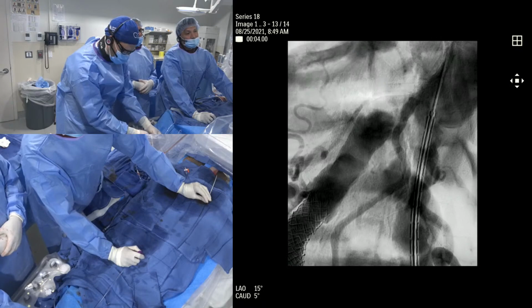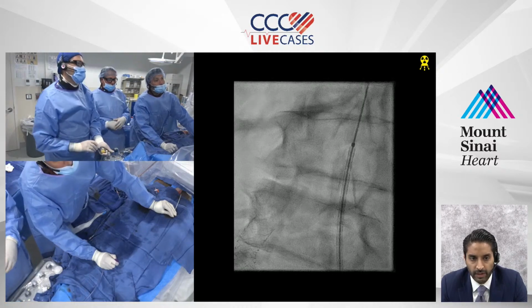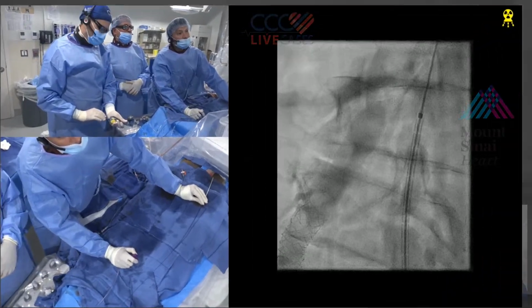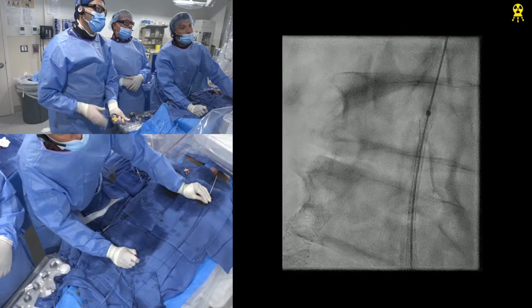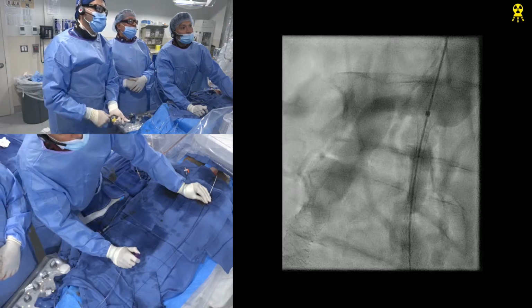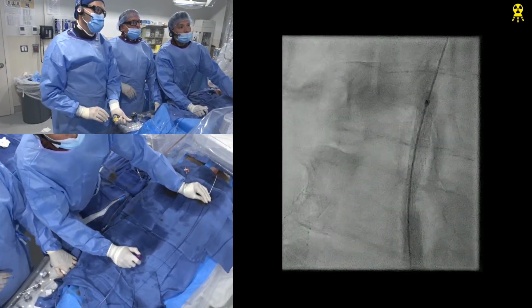Okay. So going now without the balloon protection. Because I think everybody's, at least not everybody, I'm a little remiss. I don't want to deal with the other iliac stent. So Luke's going to go up here slowly to 12. Yeah, we're good. That's 6. 8. He's going to feel it.